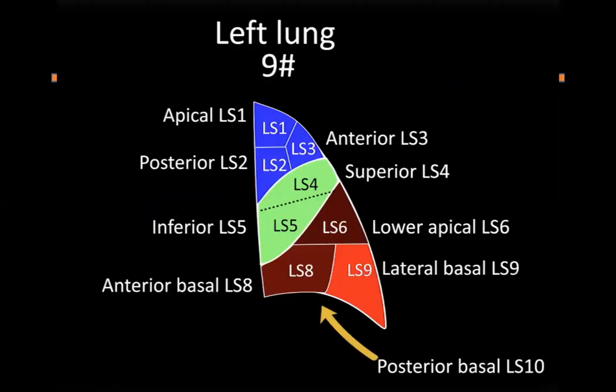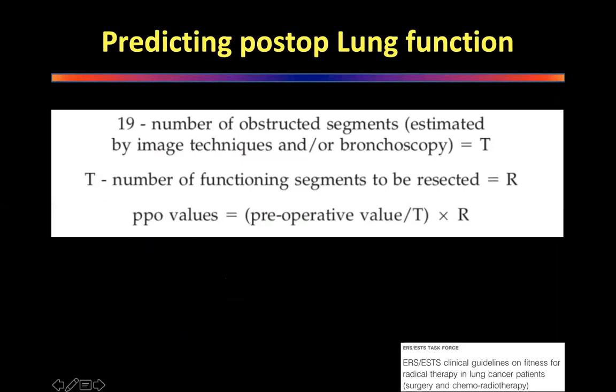So once you have this knowledge, then according to the ERS, ESTS guidelines, anytime you want to start evaluating a patient for surgery, you have to evaluate post-operative lung function. It is mandatory. And hands on heart, how many of you have actually genuinely evaluated a patient's post-op lung function? Very, very few people do it. But in the West, almost all of us do it. So look at how we do it.